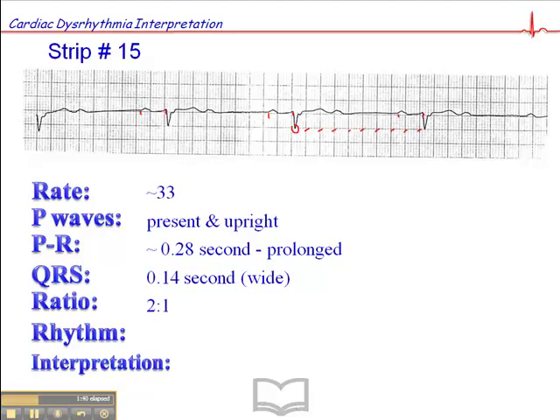The ratio, if you'll notice on this one, is 2 to 1. We have a P wave here, we have a P wave here, and we have a QRS. We have a P wave here, a P wave here, and a QRS. P wave, P wave, QRS, and so on and so forth.